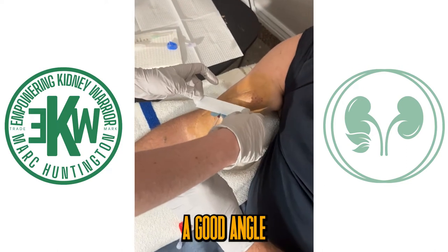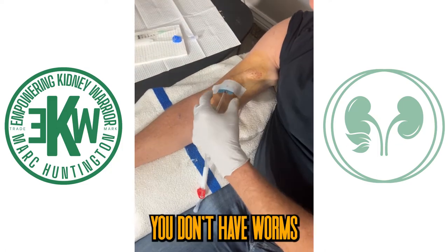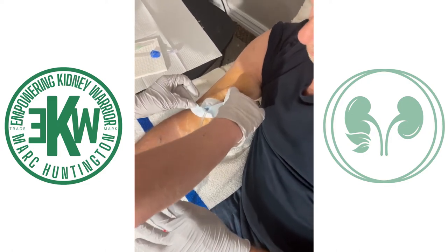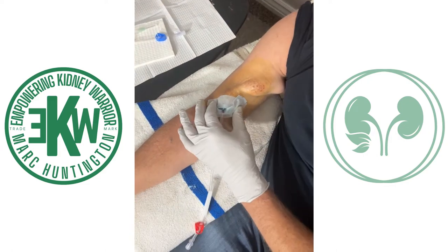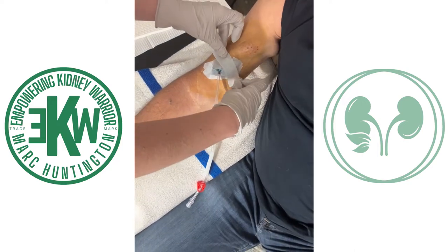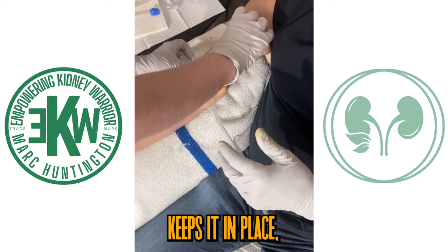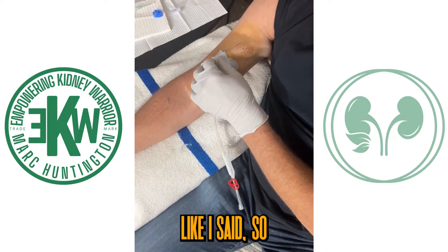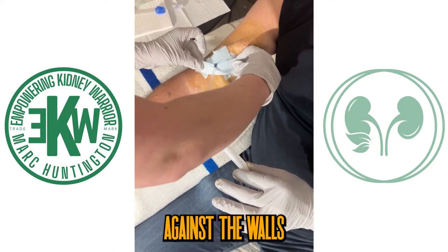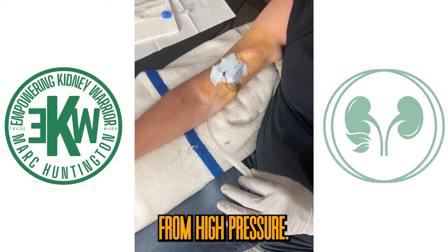It's important to make sure you have a good angle on the needle, so that you don't have high pressure. The tricky part is getting the tape ready. Taping it correctly keeps it in place so that it's secure during treatment, but also so that it doesn't press against the walls of the fistula and cause alarms from high pressure.